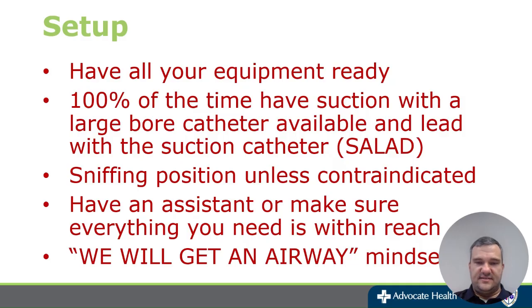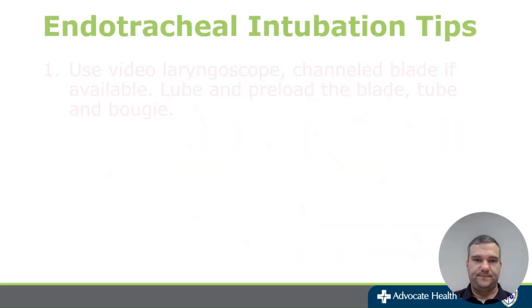And then having the right mindset, having the mindset of we will get an airway, being confident in your ability in getting that intubation completed, and not necessarily having the mindset of we need to get this airway right now in a couple seconds. Staying calm and walking your way through the intubation slowly and cautiously is going to give you a higher success rate than thinking, oh, I need to intubate this patient within a couple seconds here. And then a lot of times you panic and don't necessarily get the tube exactly where you want it to go easily.